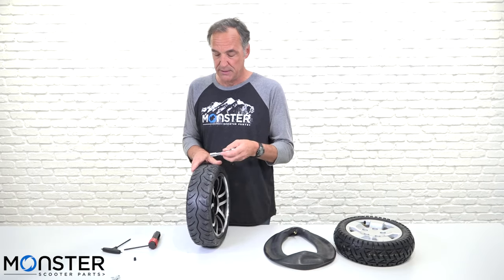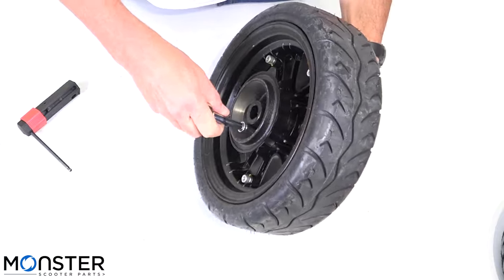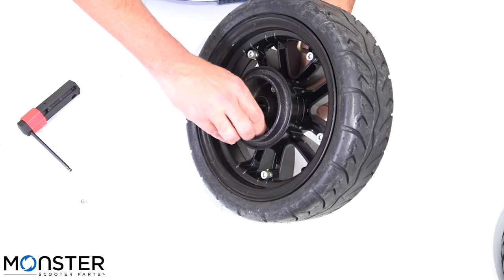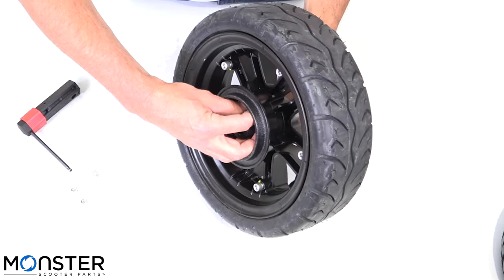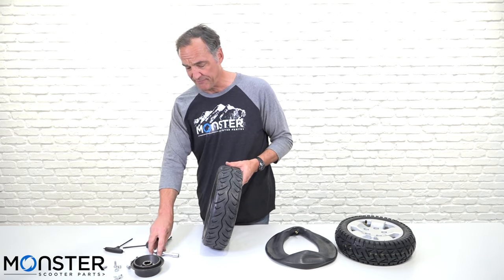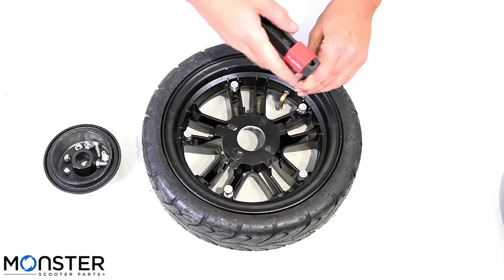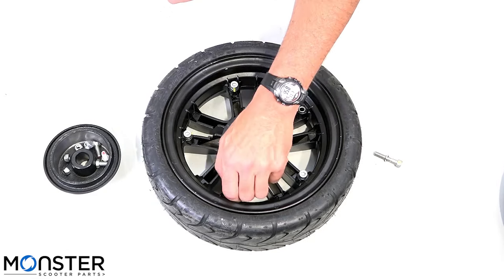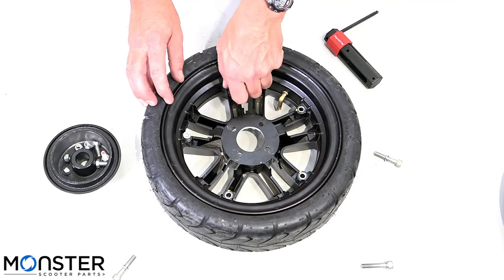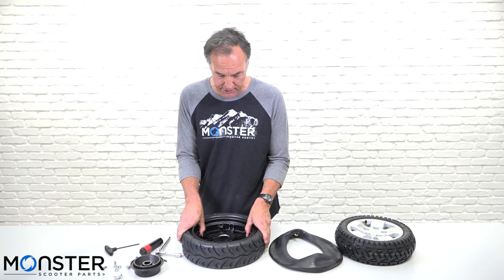First thing you want to do is take the hub off the side of the rim. Once you have the hub off the backside of the rim, you can go ahead and take apart the rim — use the Allen head wrench for this. The first time it may be really hard to get these loose, but if you just give it a little crank they should come out pretty easily. Just like a car tire, you want to go in opposite directions when you remove and install these bolts. Now that you have all of your hex bolts taken out, you can go ahead and separate the rim.